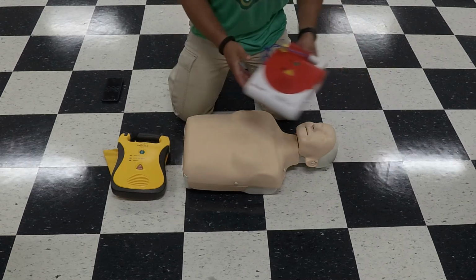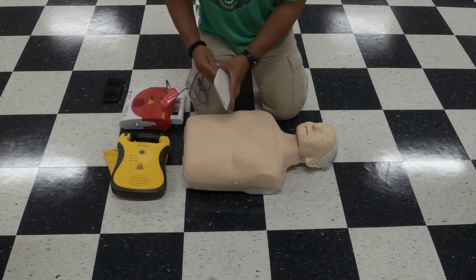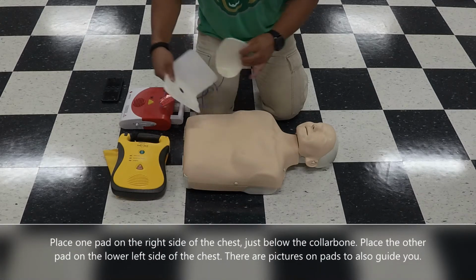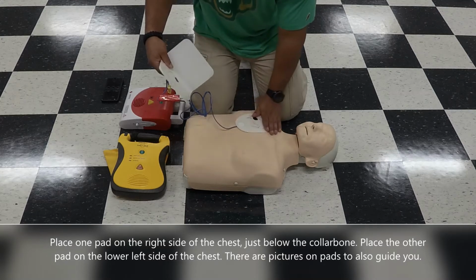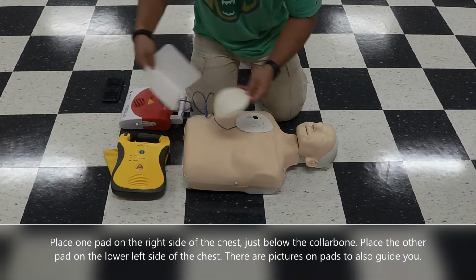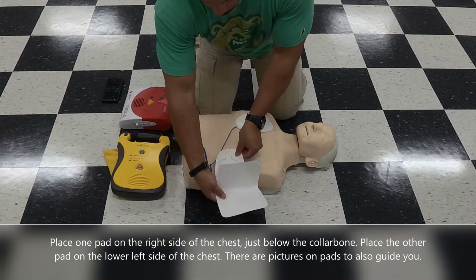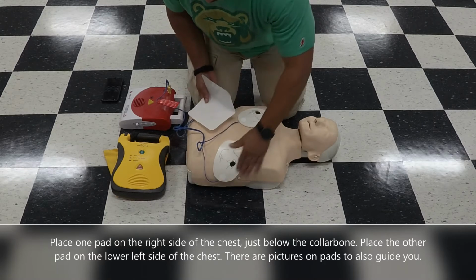The AED will not work unless a shock is necessary. The benefit of using the AED is that it's automated. It'll give you instructions. All you have to do is follow the instructions. Place the pads on the victim as instructed. You'll have diagrams on each pad.